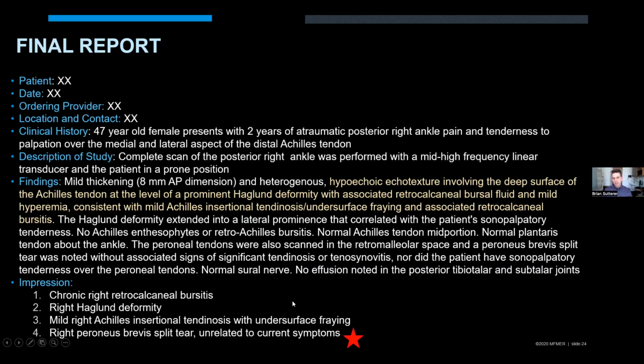I'll say one thing to consider when you're putting your reports together. I think there's a difference between scanning a patient as a referral, almost more like a radiologist, versus scanning your own patient, in deciding how much of that clinical context you want to put into your report.